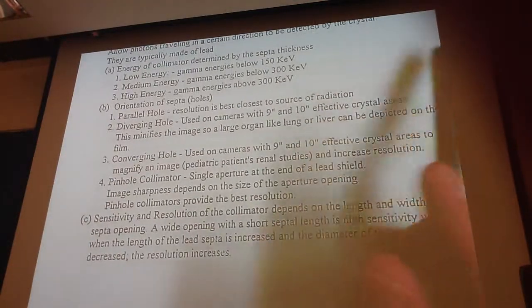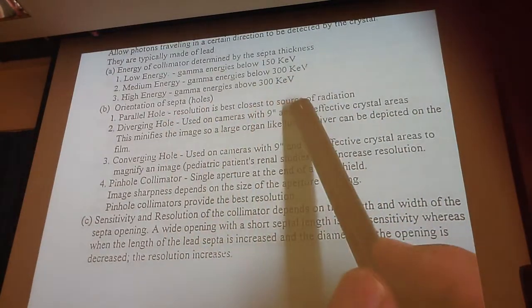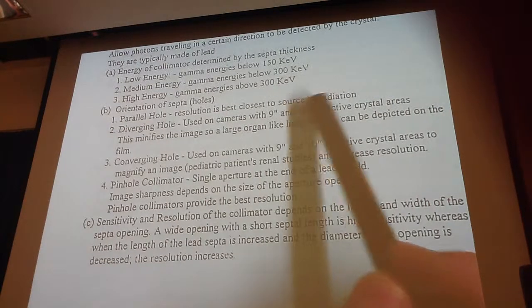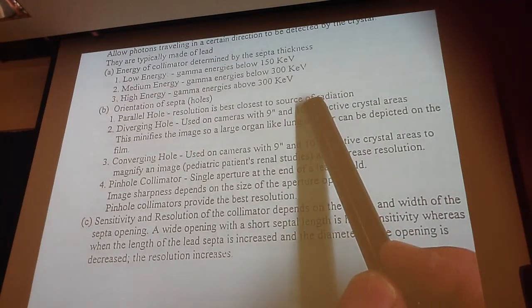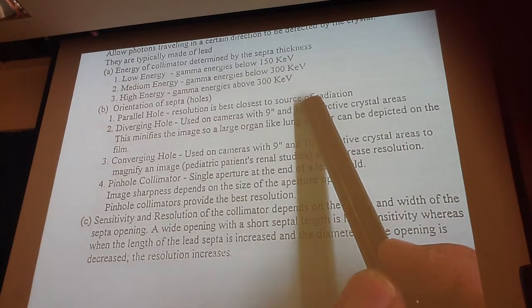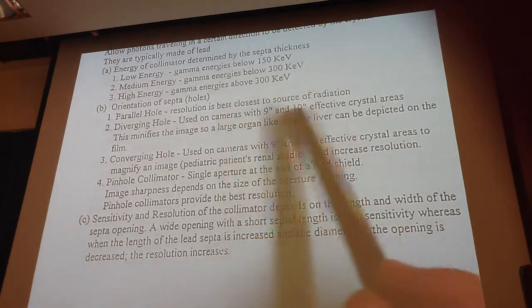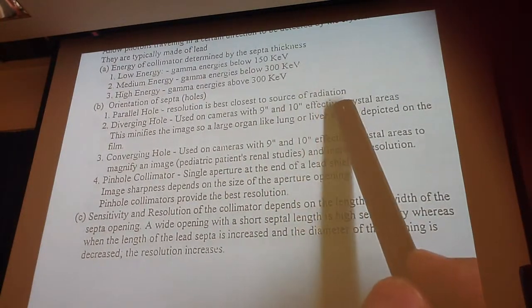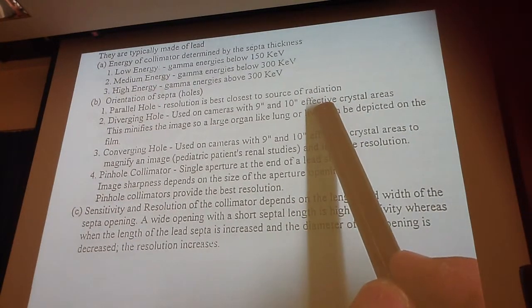The way that the holes are drilled is important because most of the time you're using a parallel hole. Basically, that keeps the image the same size. It doesn't create any magnification or minification distortion. Does that make sense? So when you're using a large field of view camera with a parallel hole collimator, basically the size of the organ that you're looking at is the actual size in the patient.